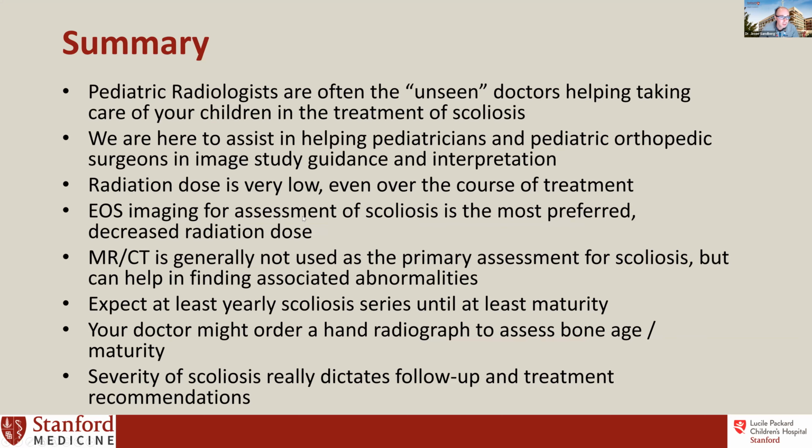So in summary, pediatric radiologists are often the unseen doctors helping take care of your children in the treatment of scoliosis. We are really here to assist pediatricians, pediatric orthopedists, surgeons, really anybody in image and study guidance and interpretation. The radiation dose is very low, even over the course of treatment.